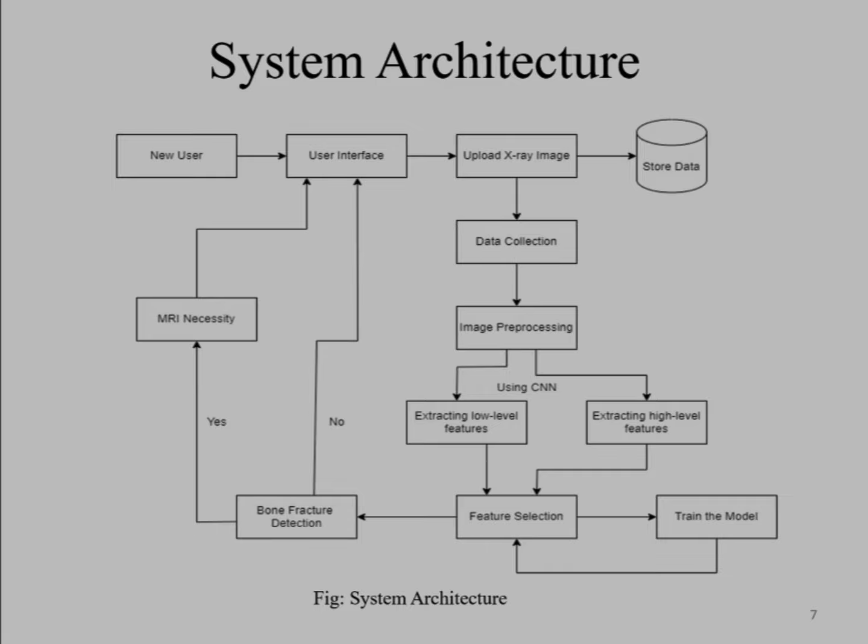Model training. Using the selected features, we train our machine learning model. This model learns to detect fractures and predict whether an MRI is needed.